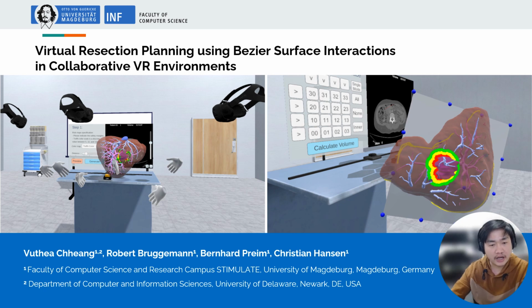The paper that I am going to present today is virtual resection planning using Bezier surface interaction in a collaborative VR environment. Without further ado, let's get started.